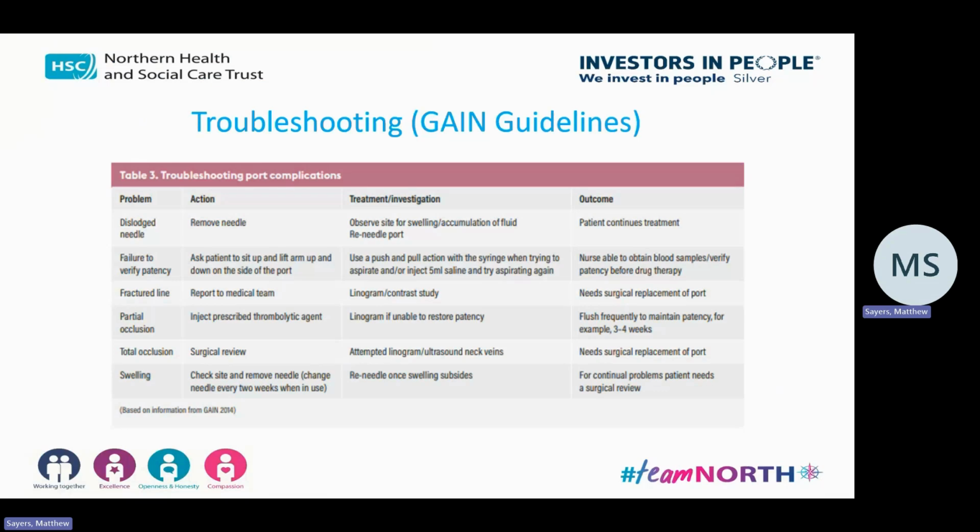It's out of our hands, because it needs to be properly replaced or turned by somebody competent to do so, and they would need to do the scan to see what was happening. They're good to know, and although you may think they're really out of date, they're the latest ones that you get, and I don't think anything's changed there.